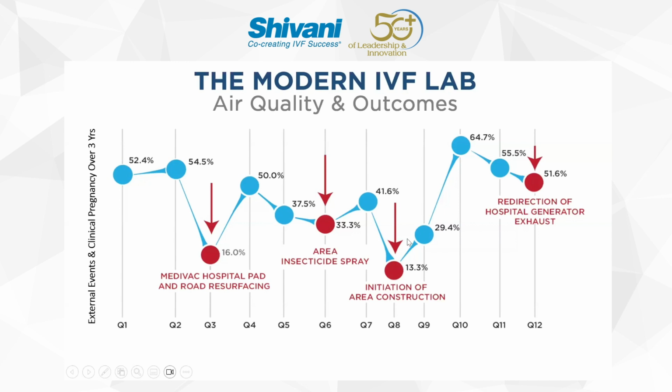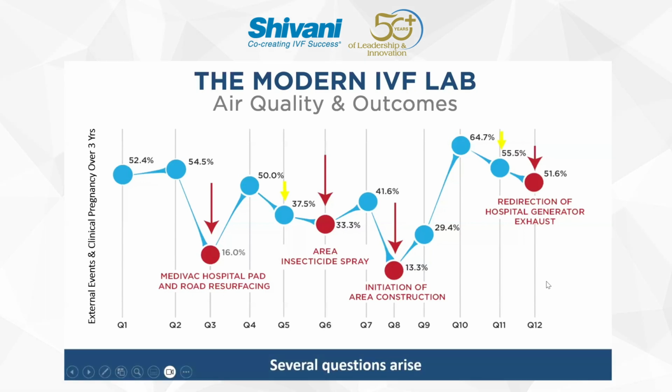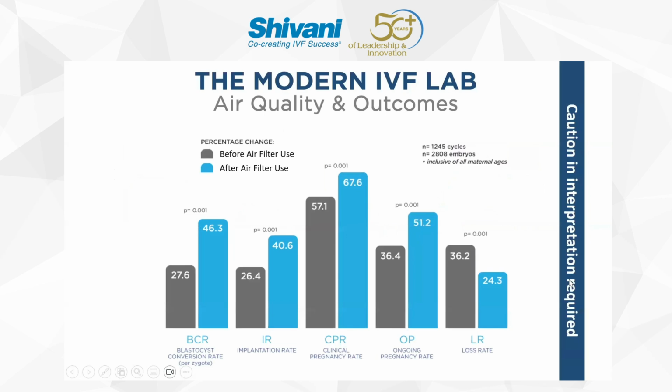There are other decreases here with no seminal outside events postulated to be the cause. And importantly, there's no measurement of air quality. So there are assumptions that air quality led to these decreases. When there's no measurement of VOC levels, you can't necessarily draw that conclusion. So far from definitive, but again, certainly leads us down that pathway.